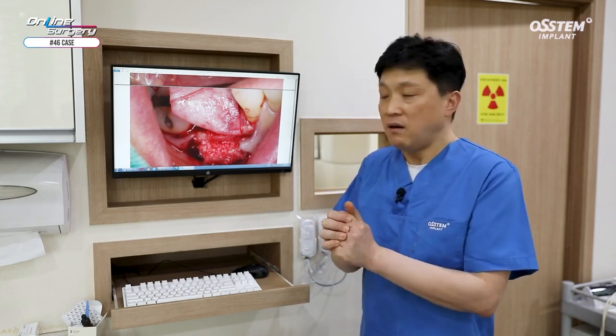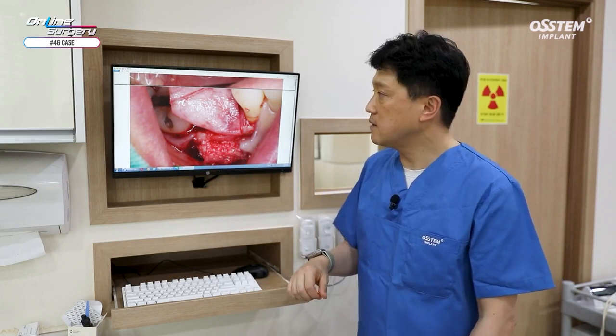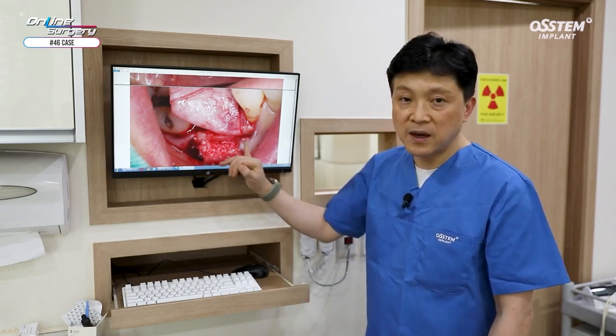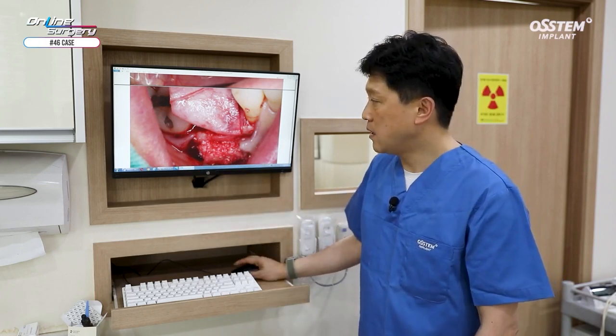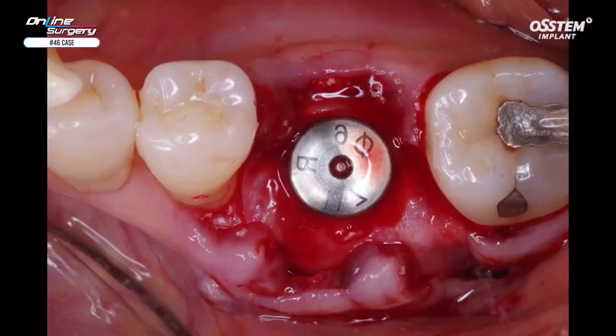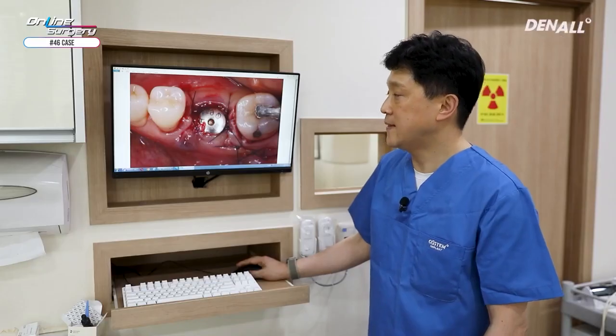Block type AS collagen with self-aggregation capability can be used here to prevent the displacement of graft materials. Membrane was adapted and 2 sutures were done. Previously, vertical incision was made to check the fenestration defect, and here 2 sutures were done to close it off.